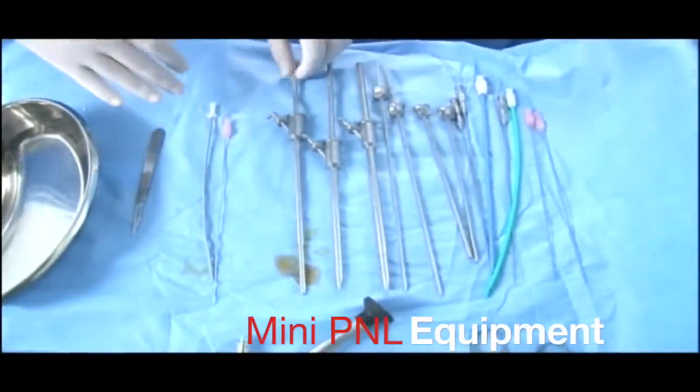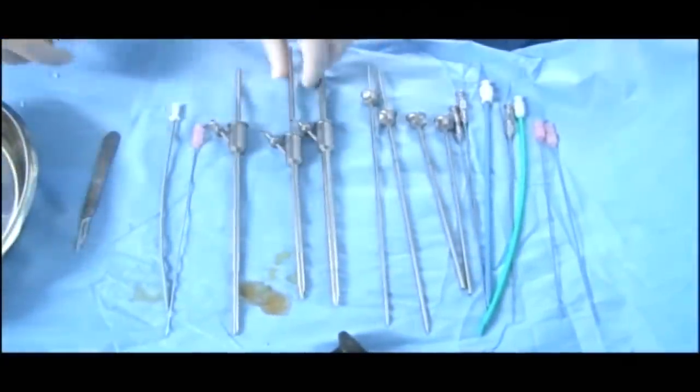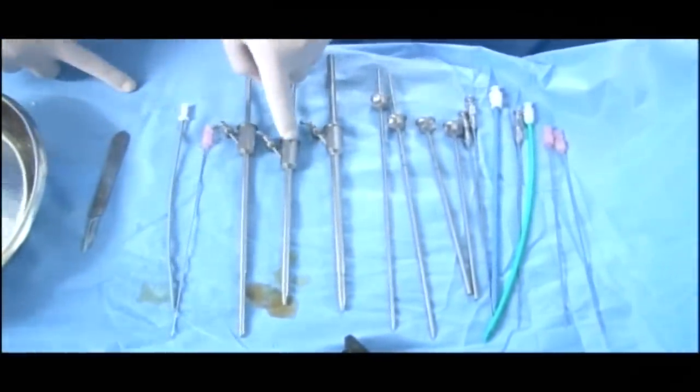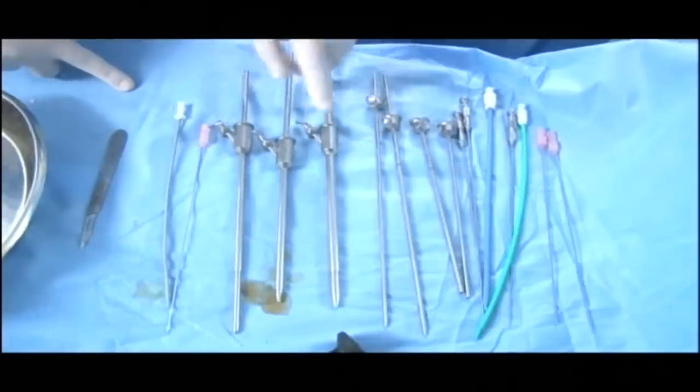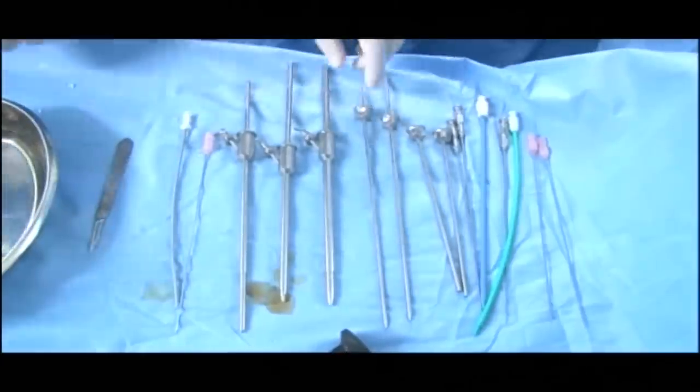This is the Galstros — this is the standard. These three are the standard mini PCNL scopes. These are the 15, 16.5, and 18.5 French outer diameters. And these two are the MIP XS, the newly launched one.